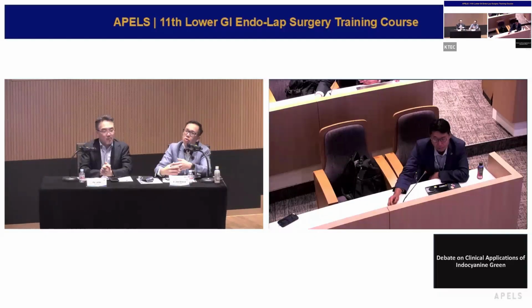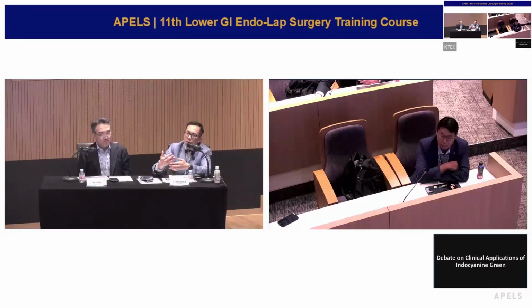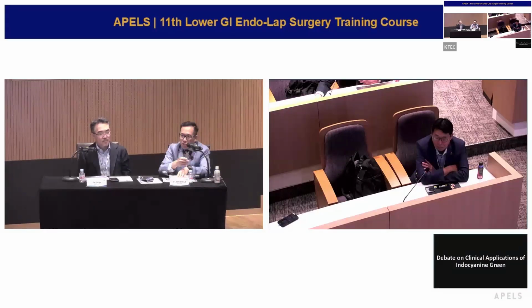I don't even want to check. But there's one time that I used it and checked, and I had some ischemia, maybe because sometimes during the intracorporeal anastomosis, during the mobilization, there's too excessive traction, and that changed my surgery, just like what Professor Meena showed on that area.